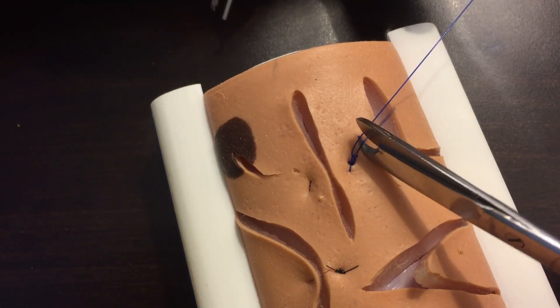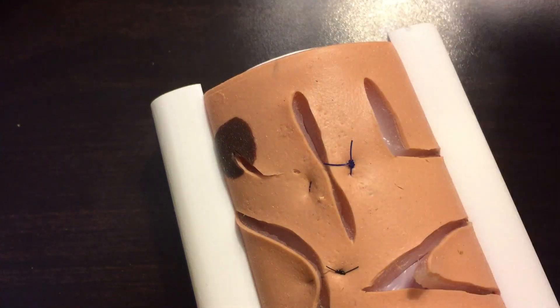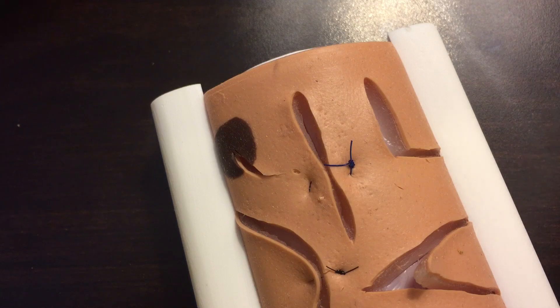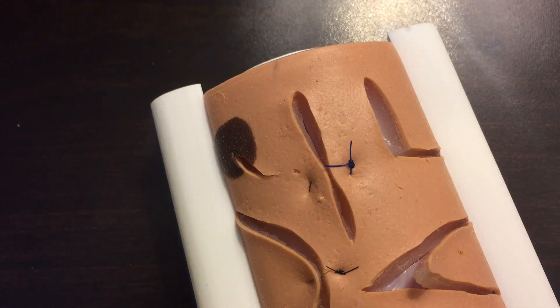If you do something under tension like this with a simple interrupted suture, oftentimes it's going to invert the skin edges even if you did everything correctly. You just have too much tension then, so it turns everything in.